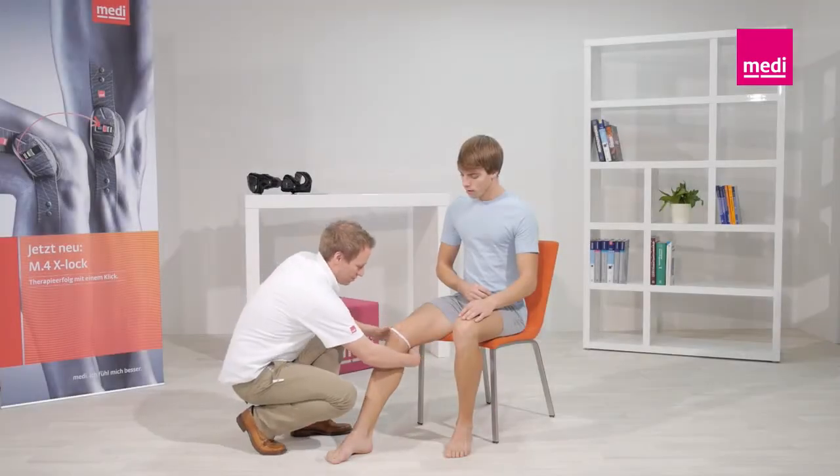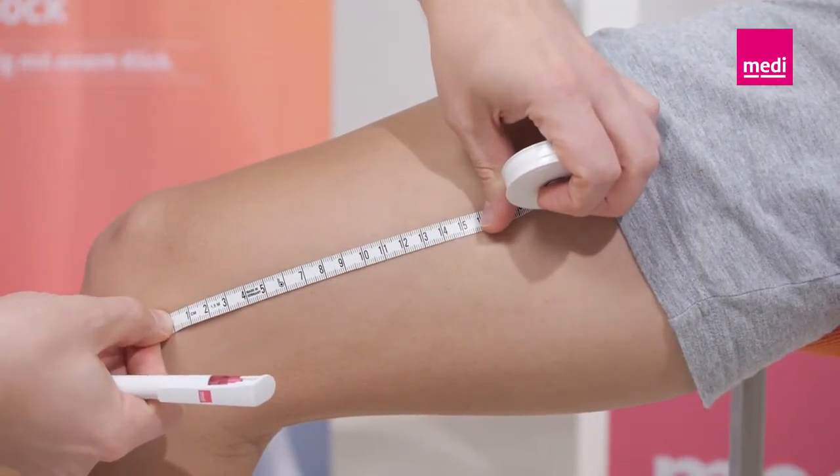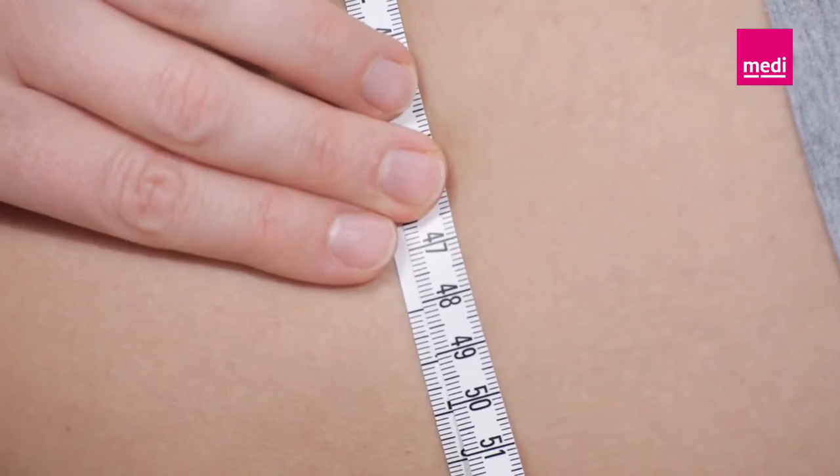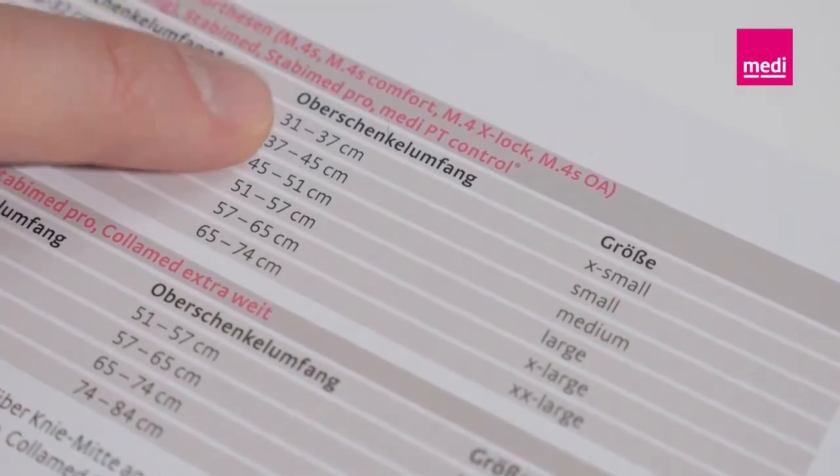To determine the right size of the orthosis, please measure the circumference of the affected leg 15 cm above the middle of the knee joint on the medial side. Then you can select the suitable product from the size chart.